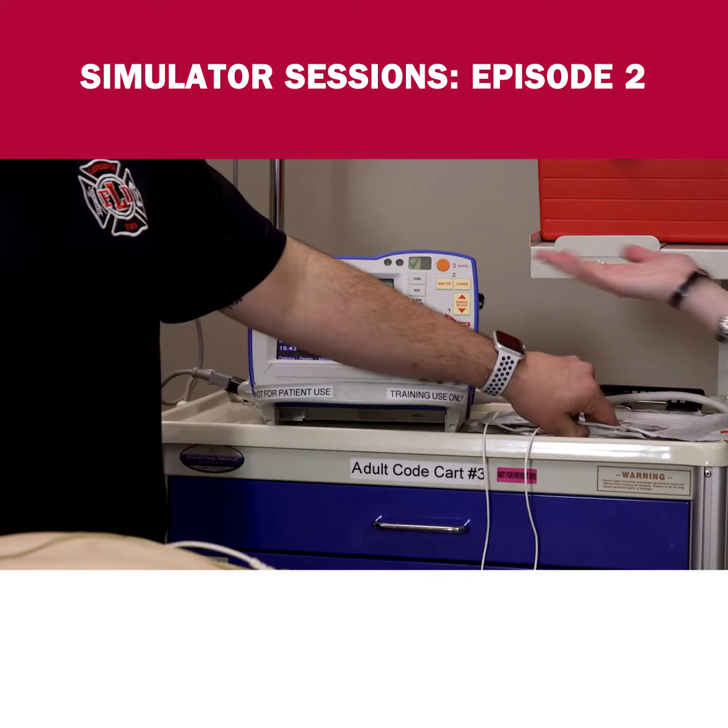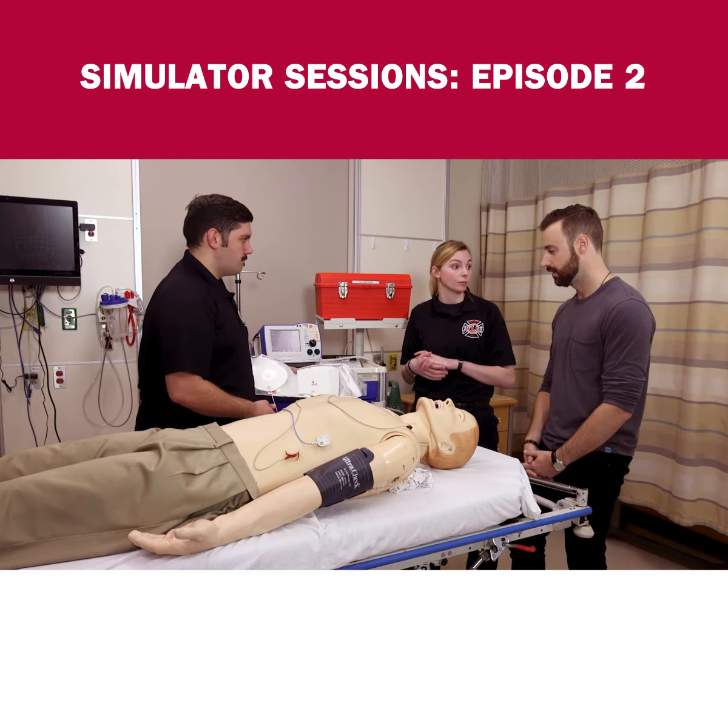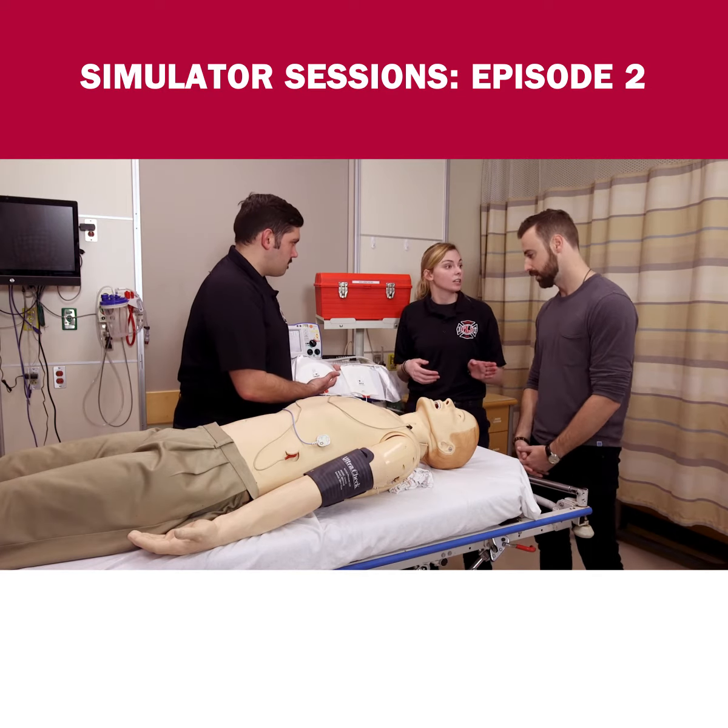All right, that's obviously not good — those are bad squiggles, it's just all over the place. We're going to have to do something called defibrillation.